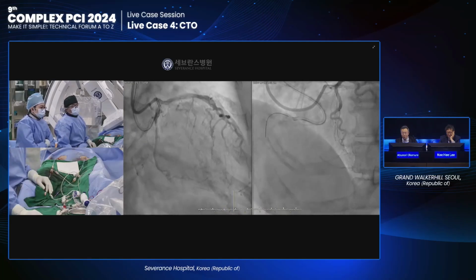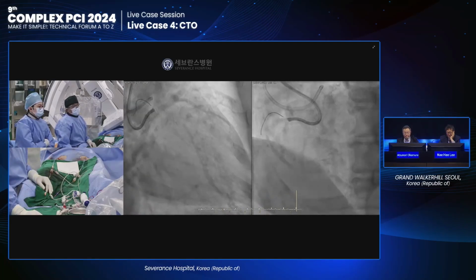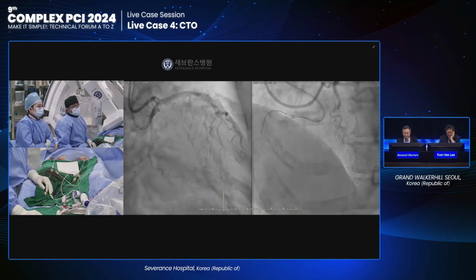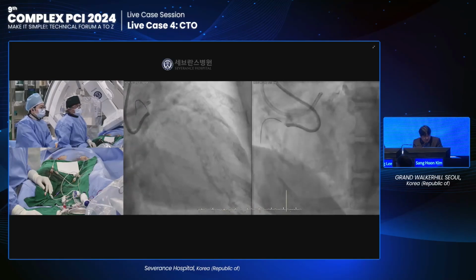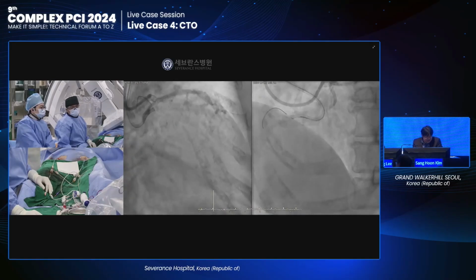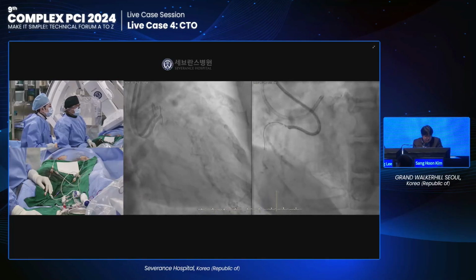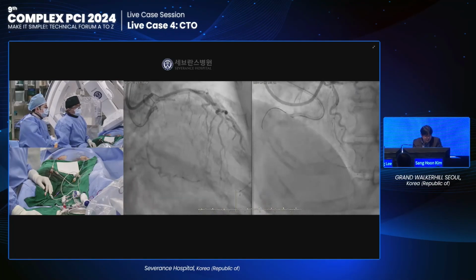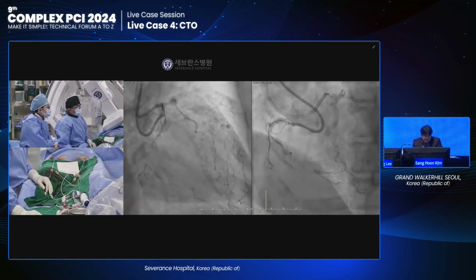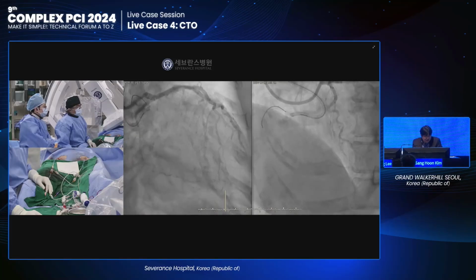Dr. Byeong-Keuk Kim, I'm Sang Kim. Your angiograph frame rate is too low, so I cannot confirm whether the LAD stent position is mid LAD or proximal. We cannot definitely see the stent position in LAD, and there is some possibility that the LAD stent compromises the septal branch collaterals, and that makes some difficulty for retrograde wiring.